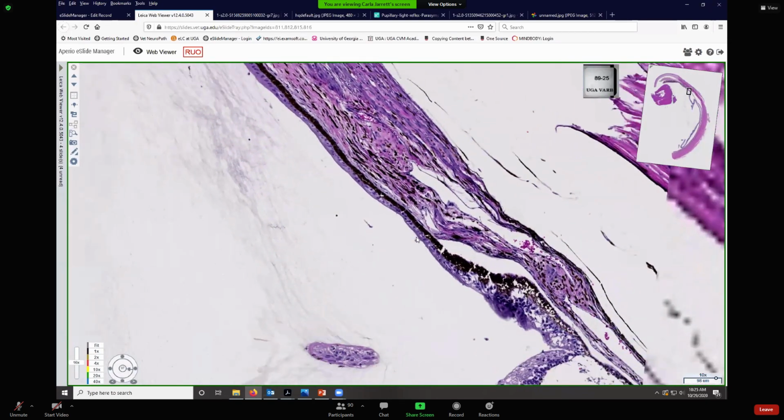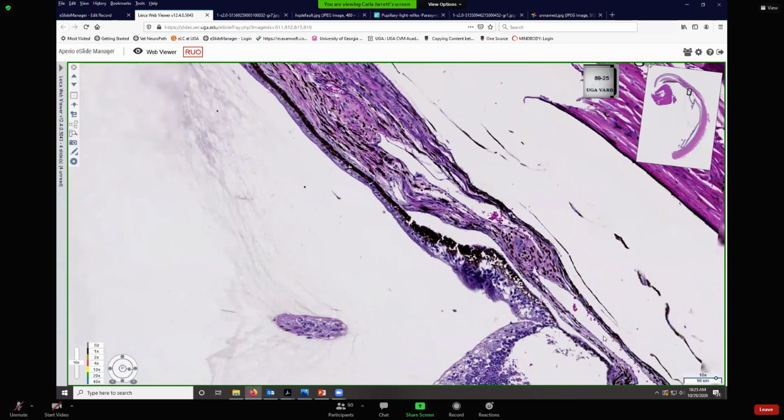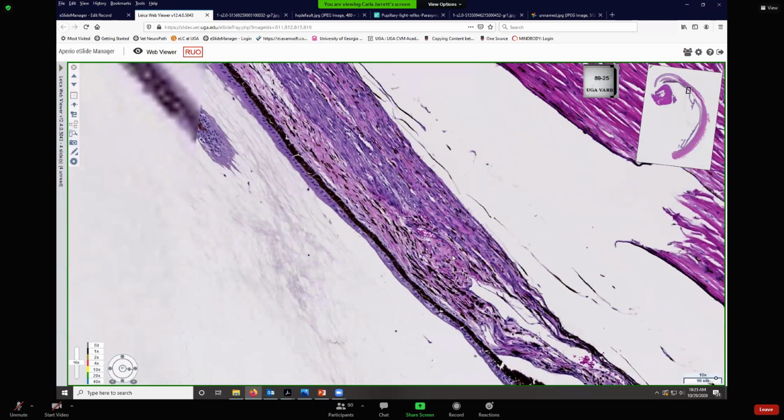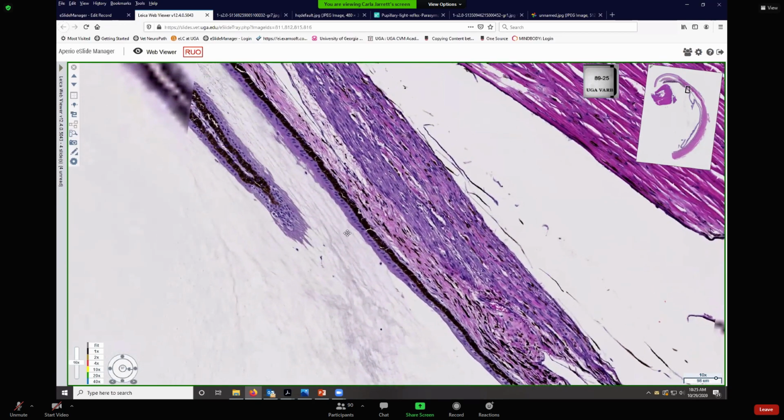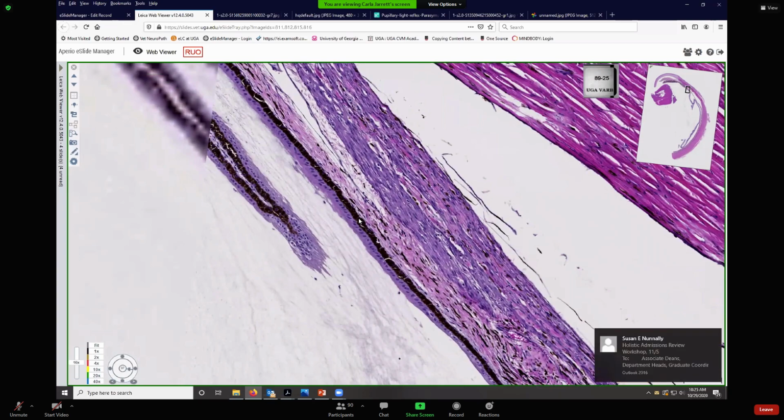And when you hit that bilayered epithelium, it overlies the continuation of the choroid, which is the ciliary body, as you're moving anteriorly. The ciliary body is part of the uvea, as is the iris. And it's overlaid with the non-visual portion.